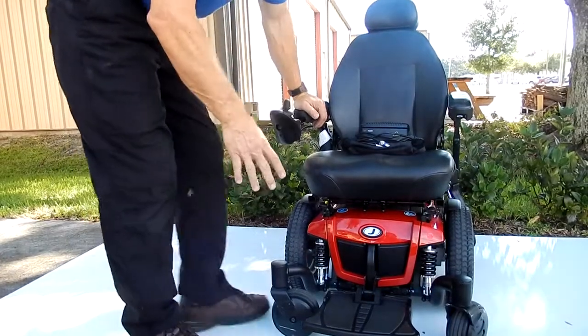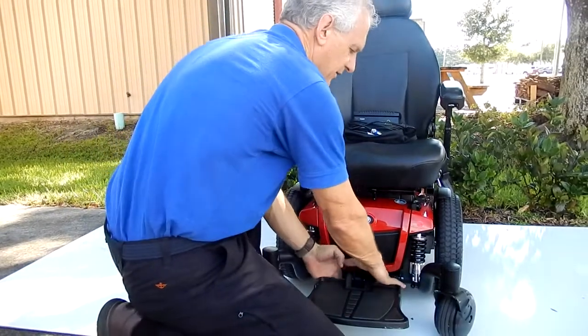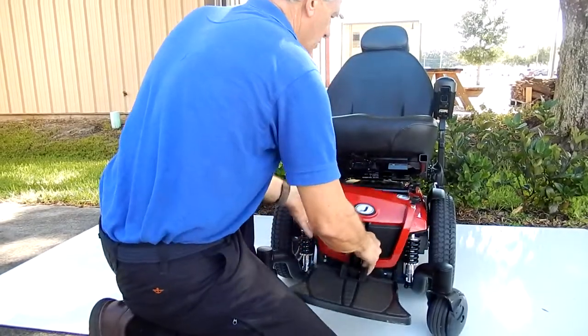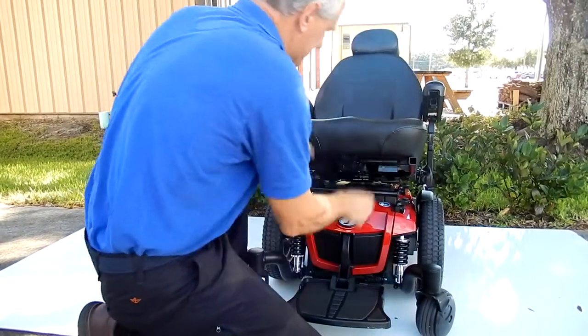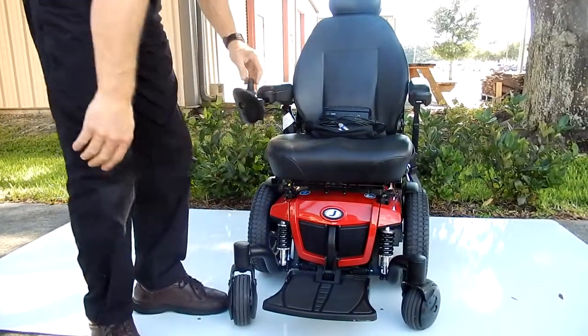To get to the batteries on this chair, you just pull the two levers up front together, snap the seat up, pull the front panel out — and there are your batteries. Put the cover back on, snap your levers back in on both sides, and snap your seat back on. This is how you get access to your batteries.